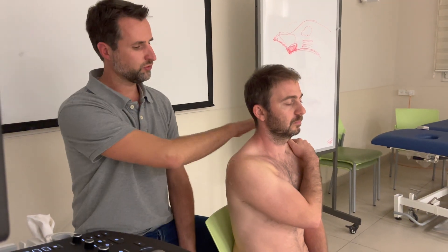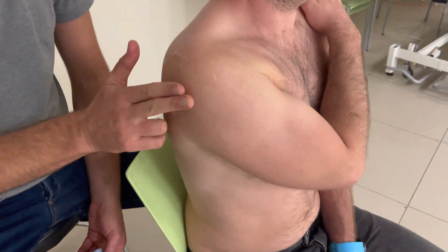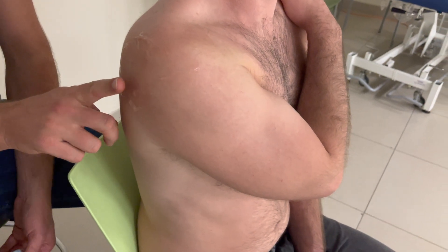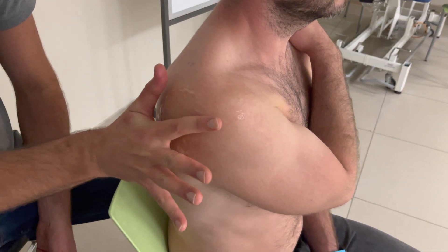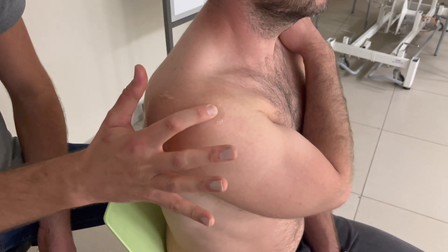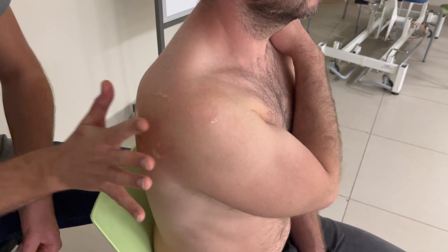We're going to look at the infraspinatus in the long axis view. We place the hand on the contralateral shoulder, which makes the tendon nice and taut going around the shoulder. If I visualize the tendon, it comes up very obliquely, doesn't run in the transverse plane, but goes obliquely up, wraps around the shoulder, and inserts here on the greater tuberosity. This is more or less the angle we will use to scan it.